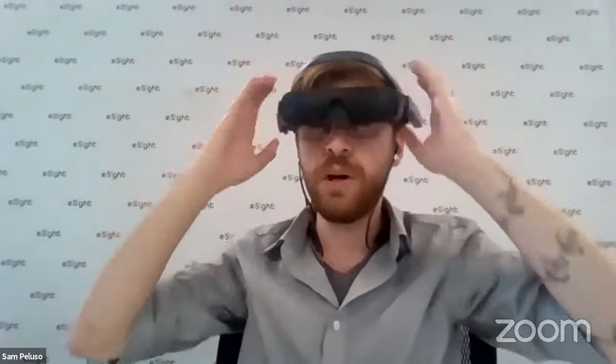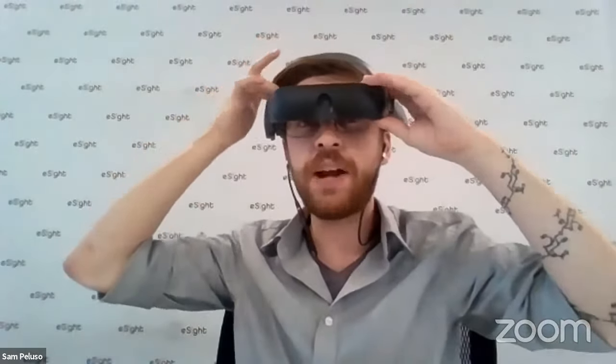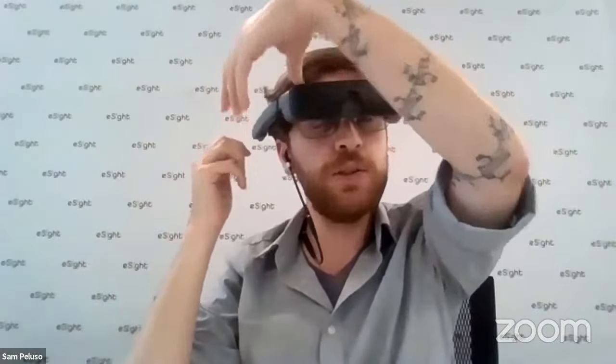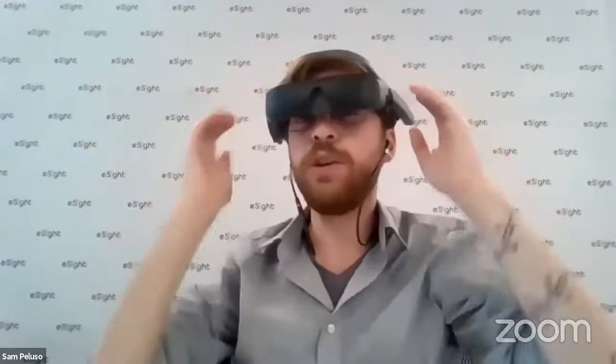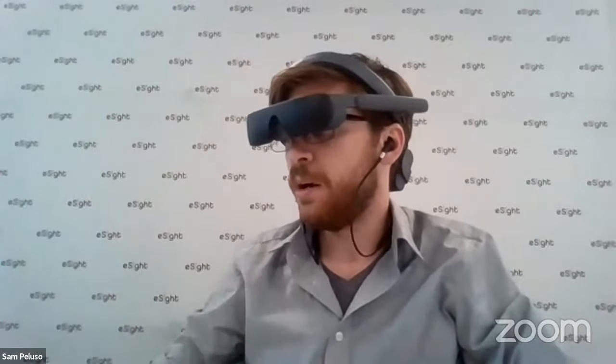Yeah, that's cool. And I think with the touchpad, it's not access to all the functions. It's just the magnification and the colors. Is that correct? Yeah, there are a few things that are remote specific that you do need the remote to get to. There are some ways, like you can actually change the color filter using the touchpad if you really know the controls well. But you can't take photos with the touchpad. You can't record video. But that is something that I can do with the remote here.